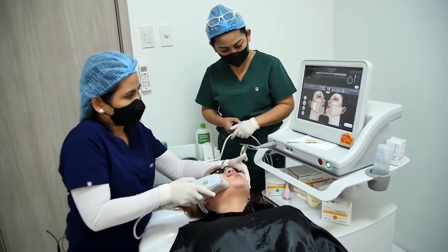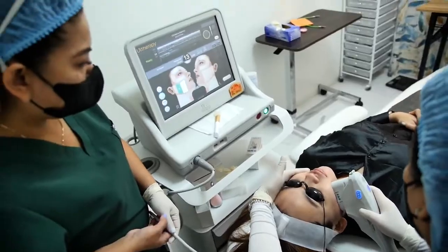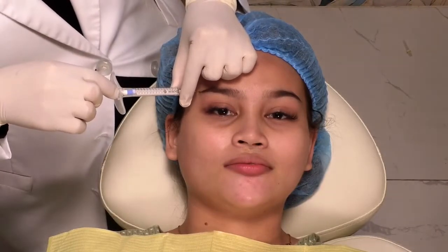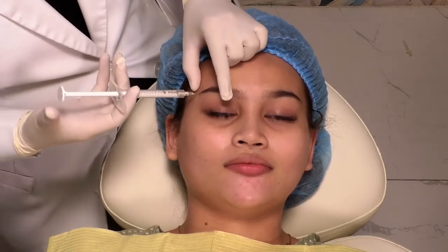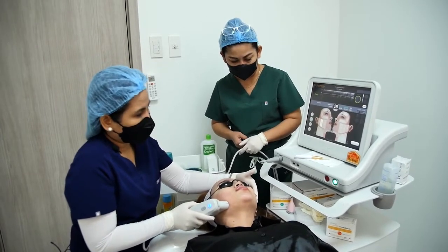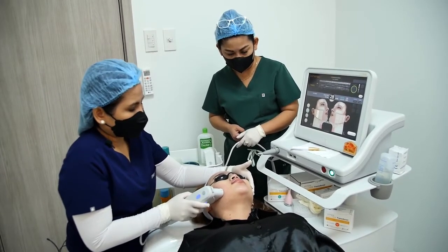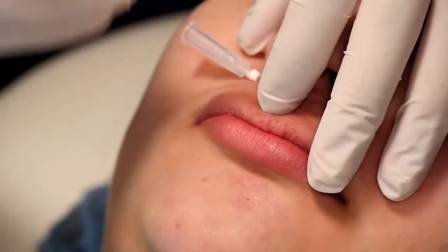For procedures like your lasers or energy-based devices, you can use the spray. Or even your injectables like your Botox or dermal fillers, you can use it in your treatments. Patients really appreciate it when you help them with the numbing to reduce any pain or discomfort. We want them to feel comfortable and not really feel those pricks, especially when doing needle injections, so they're not pained by those sharp needles.